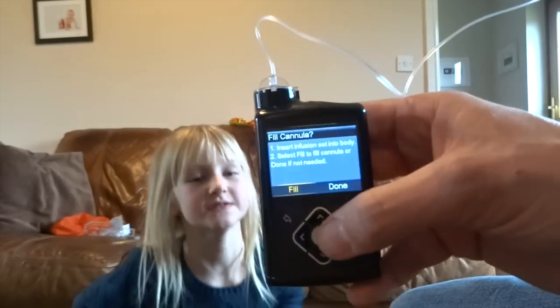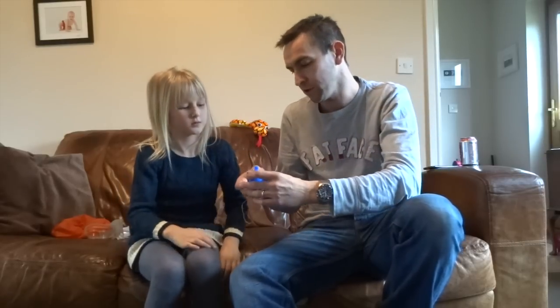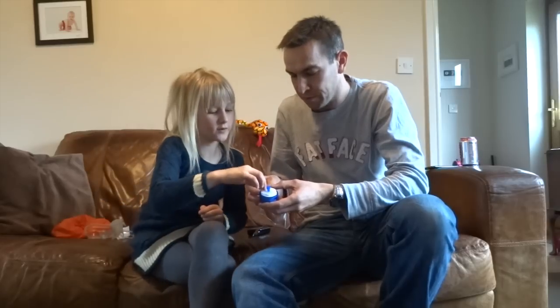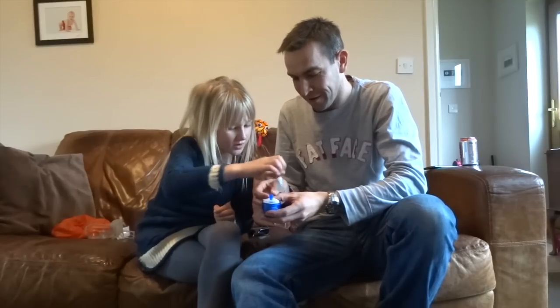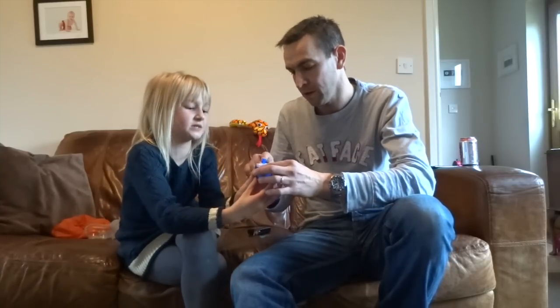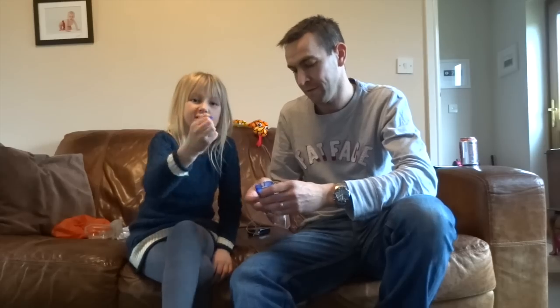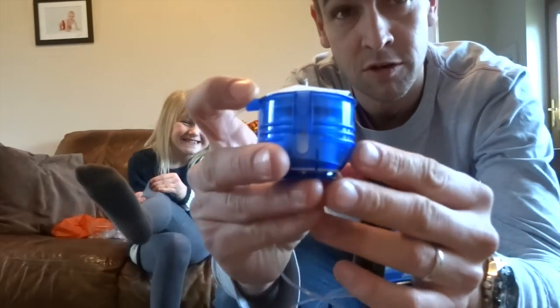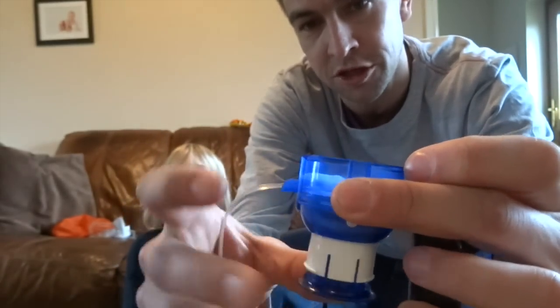Next. Insert infusion set to body. So this is the bit with the needle — not a very big needle. Do we put it down first? No, we put it in as it is. I hold it on. Take off the sticky adhesives — they go in the rubbish pile. I struggle to get the second one off every time. And we pull this down, and then we spin this a little bit. Take it off. There will be a needle, and this bit will be off. You can see the length of the needle there, and inside there's the part of the tubing that's left inside the body.